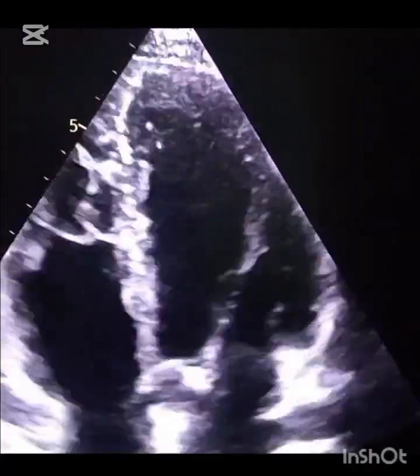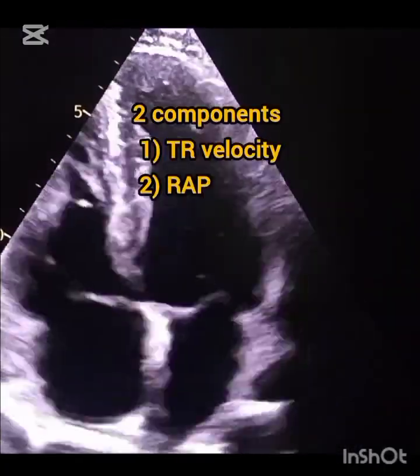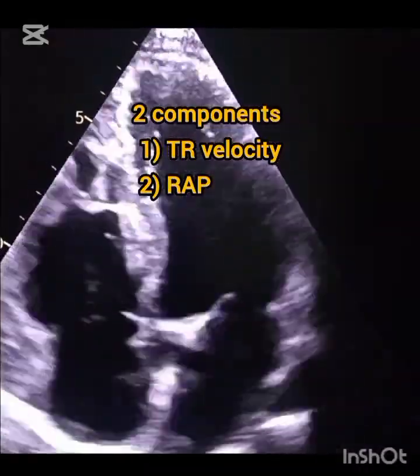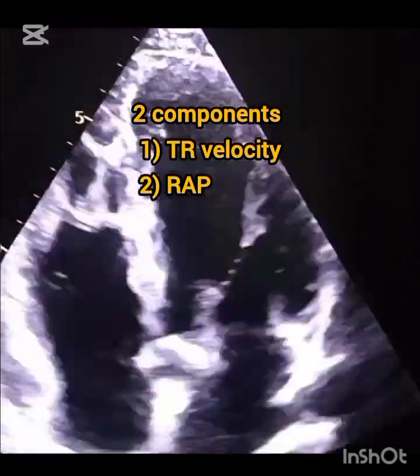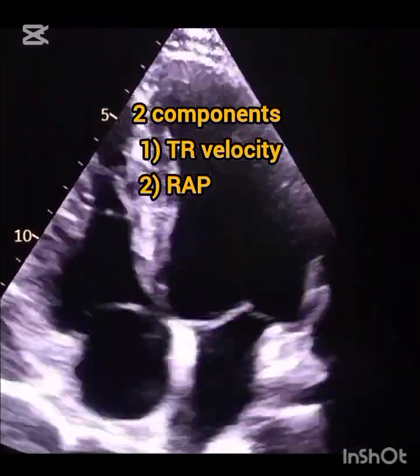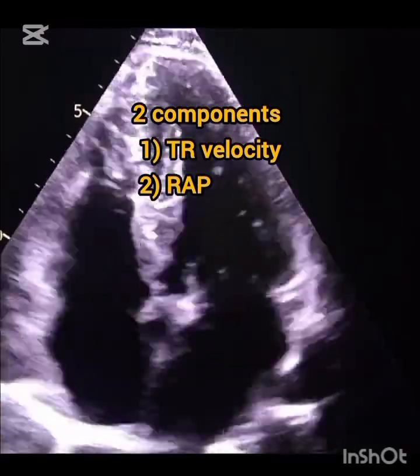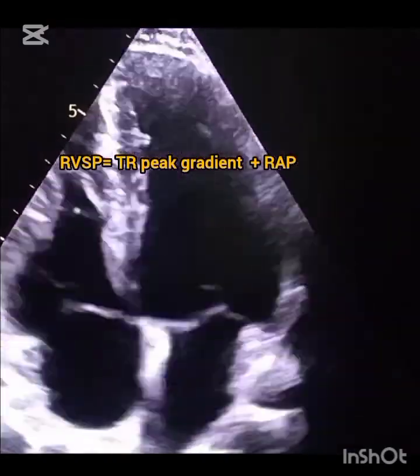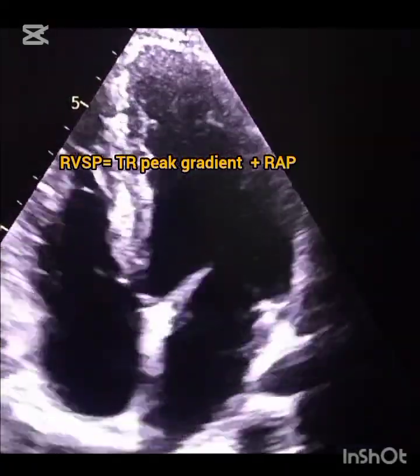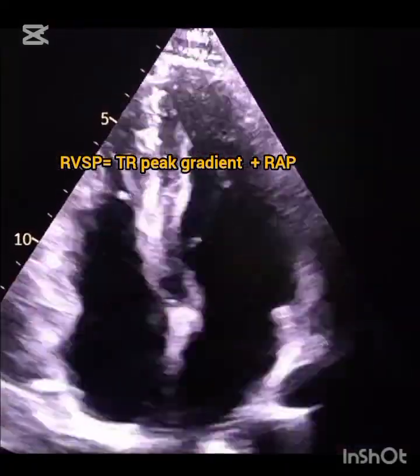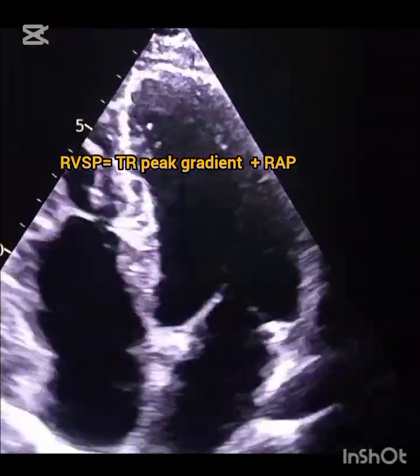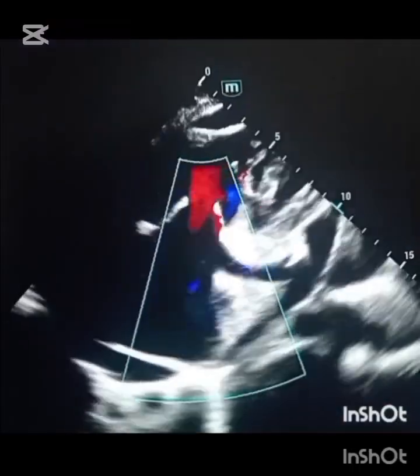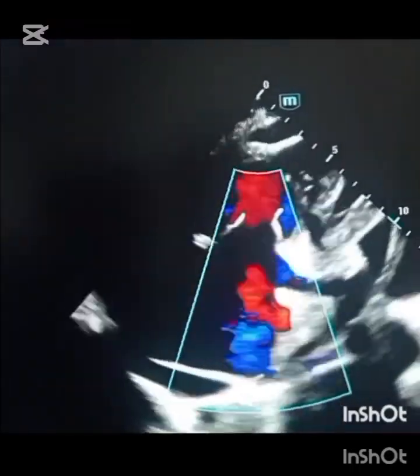How do we obtain RVSP? There are two components that contribute to determining right ventricular systolic pressure. Number one is tricuspid regurgitation maximum jet velocity. Number two is right atrial pressure. We add the tricuspid maximum gradient plus right atrial pressure to obtain the right ventricular systolic pressure.